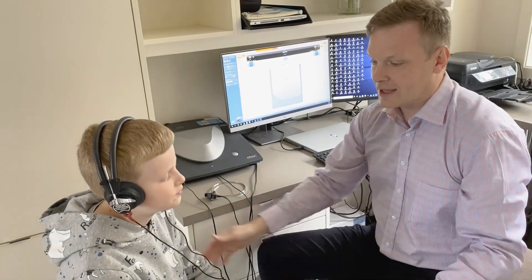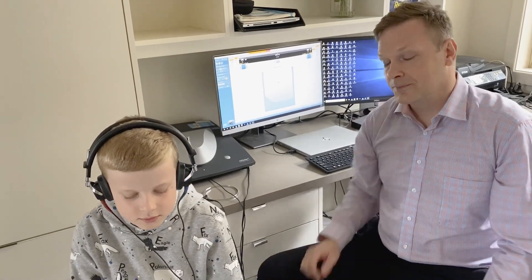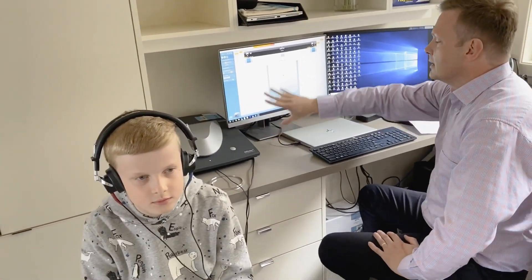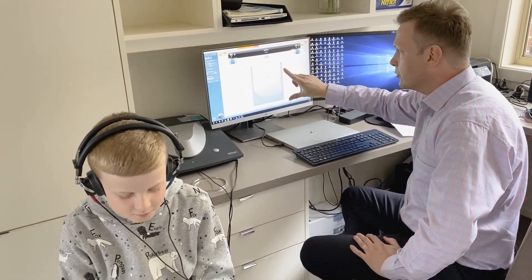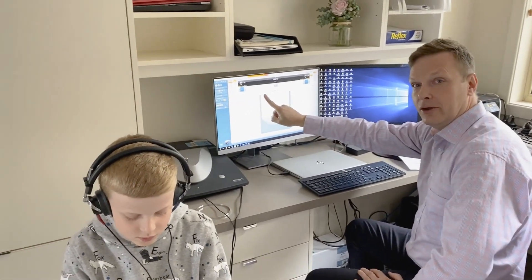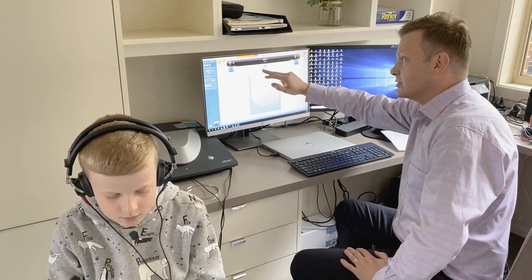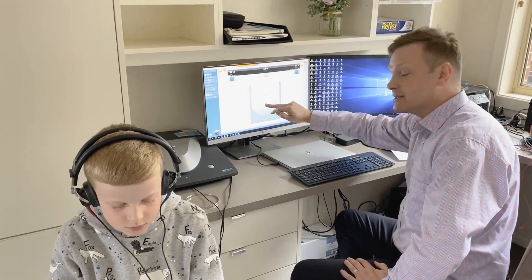Good. We're going to get the patients to not face the screen. Normally we wouldn't be talking throughout this period, but today I'm just going to talk through the actual technique of finding the threshold. Here's our audiometer screen — this is a software-generated audiometer. We've got pitch going from low all the way up to high, from 250 hertz up to 8 kilohertz, and we've got volume or decibel levels going down.